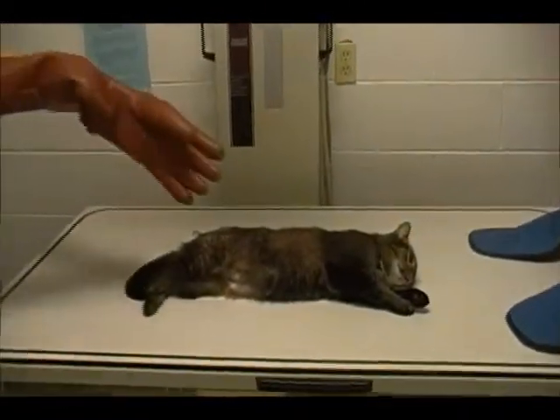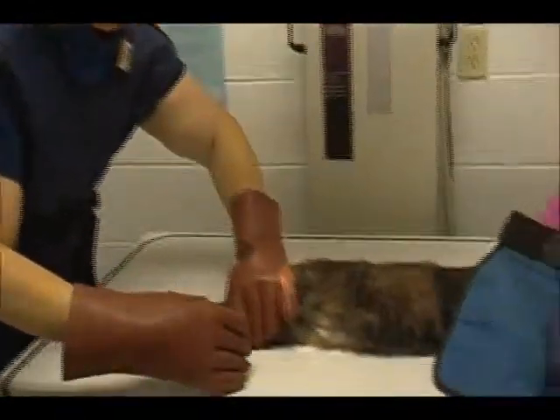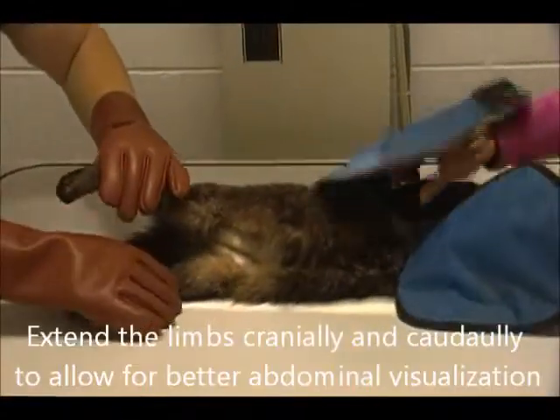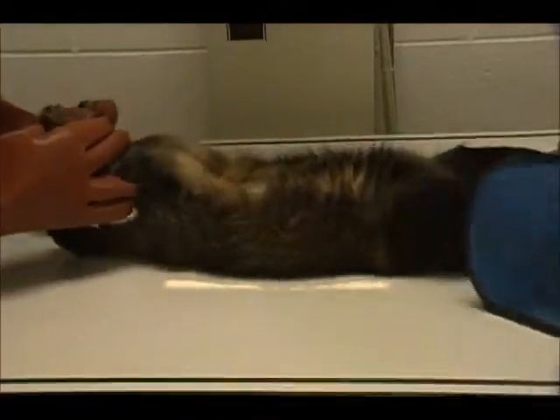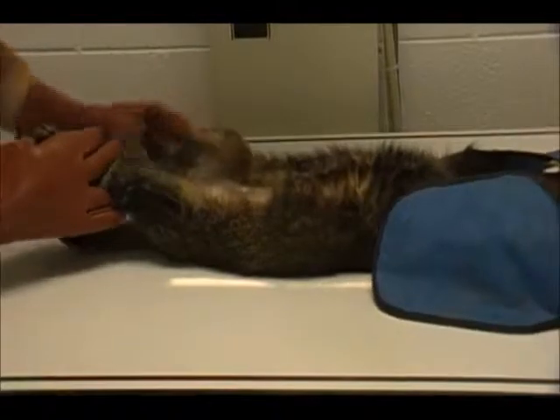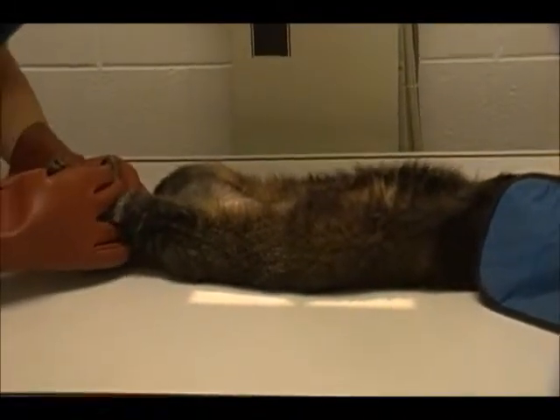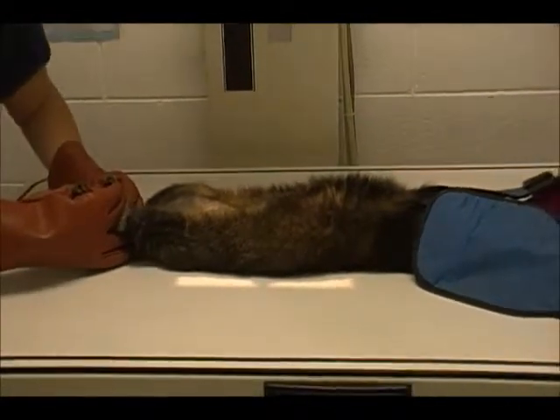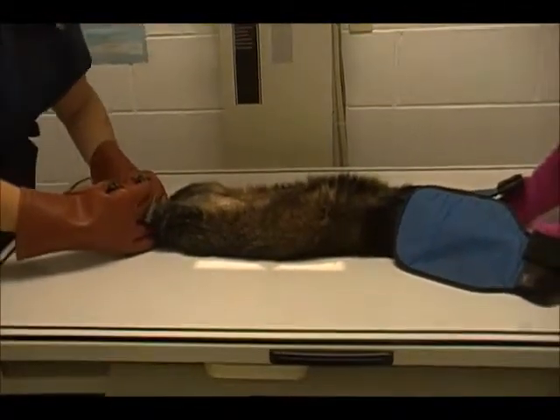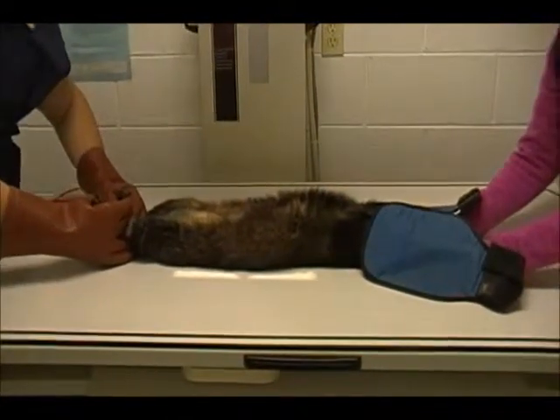We're going to stretch the cat out and center him over the light for the VD. We want to have it from about the heart area towards the caudal end of the cat, but not extending too much on his limb.